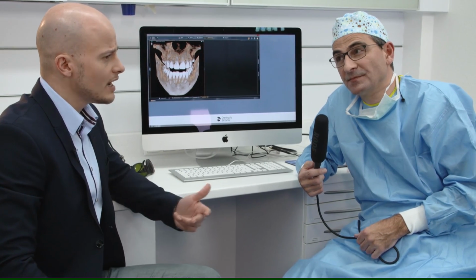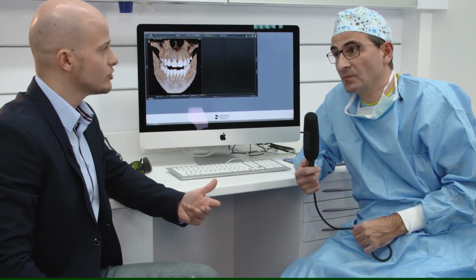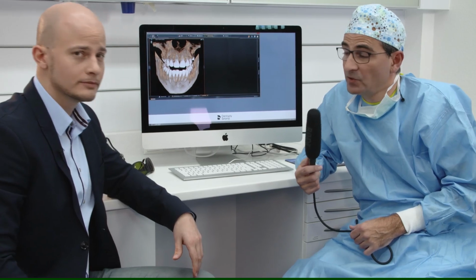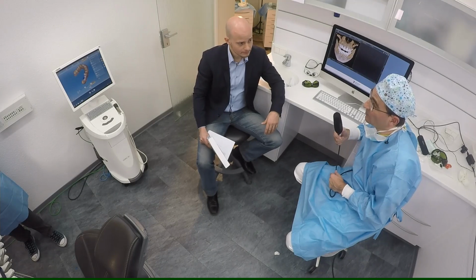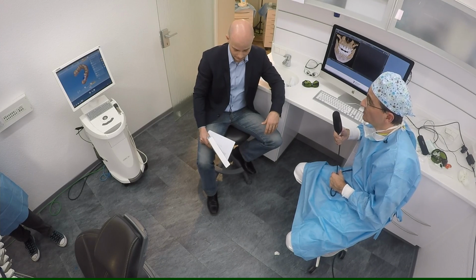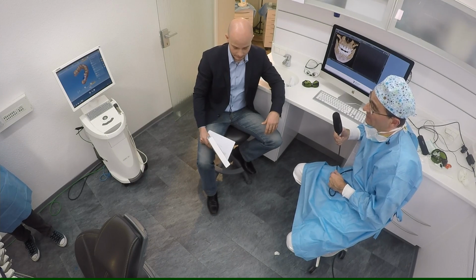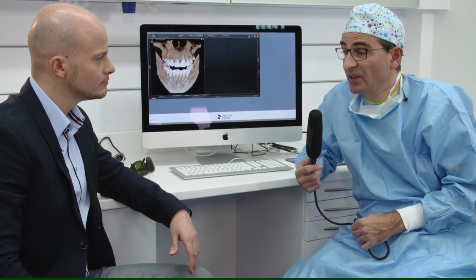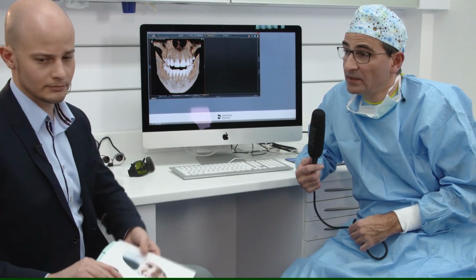So what are the next steps for the patient? We have to wait until the implant osseointegration is finished. I think we will wait another 4 months, maybe 6 months, because the distal 4.5 implant is only seated in augmentation material, I think. So it's better to wait a little bit more.